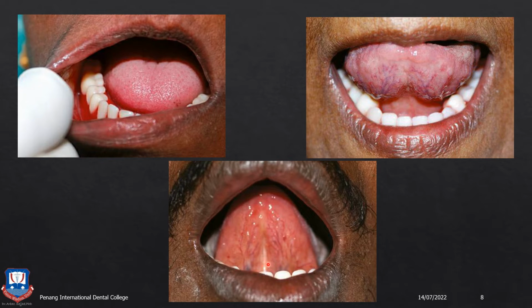You have to check for the lingual frenum relief, especially here in the Penang area. What I have seen in the past 2 months is that most of the patients have a very high frenum attachment, or something similar to a tongue tie. So you have to give extensive lingual frenum relief for the stability of the denture.